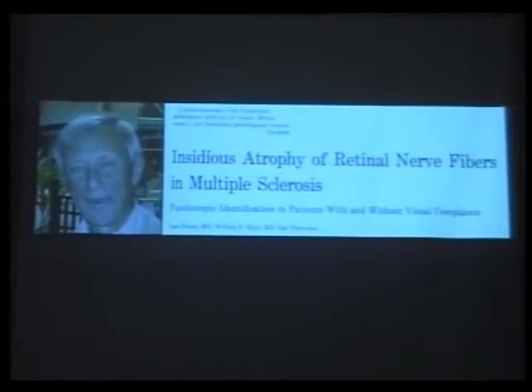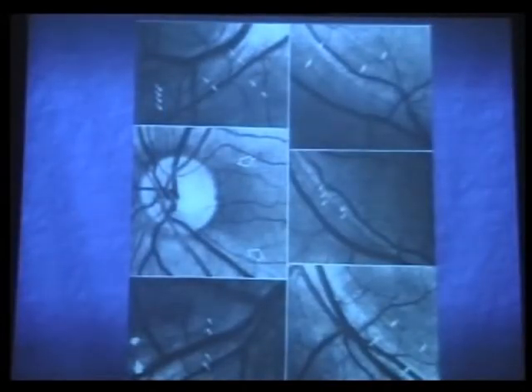So he did a similar sort of study in very few patients in a neuro-ophthalmology clinic, and he took a couple of people with optic neuritis, and these are the pictures from those publications. Here they would do these painstakingly in-focus, red-free retinal photographs, and they would correlate these troughs, where it's more black and the retinal nerve fiber layer is missing, and they did static perimetry using a Tübingen-type machine, and were able to correlate these defects to visual field defects on the perimeter.